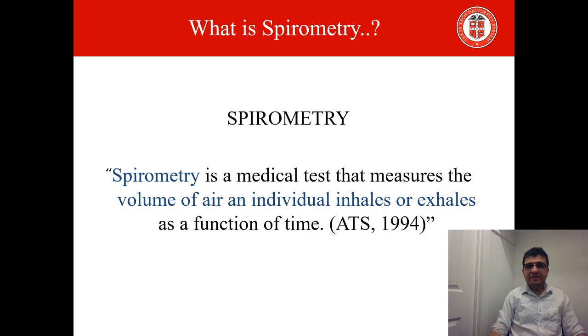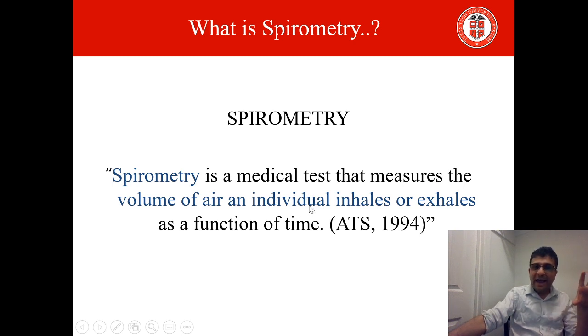Now, what is spirometry? As per the definition, as you can see on the screen, the American Thoracic Society says that it's a medical test that measures the volume of air an individual inhales or exhales as a function of time. So if you go back and think about the definition of PFT which we talked about, these are the same two components. That is the volume of air, and in the context of time, the flow or the rate, that is what spirometry measures.